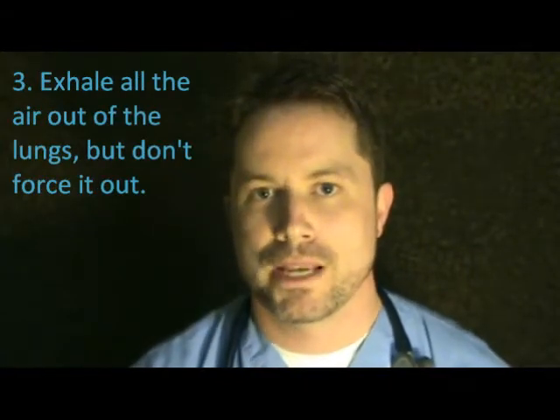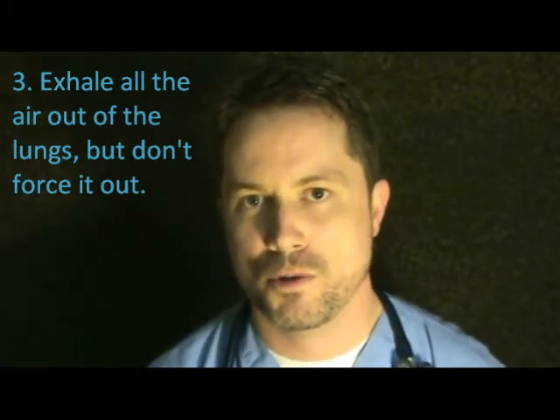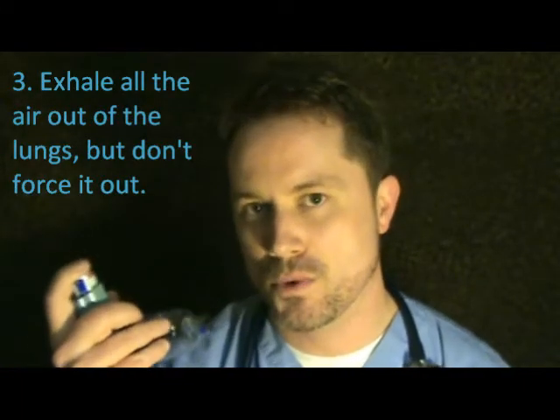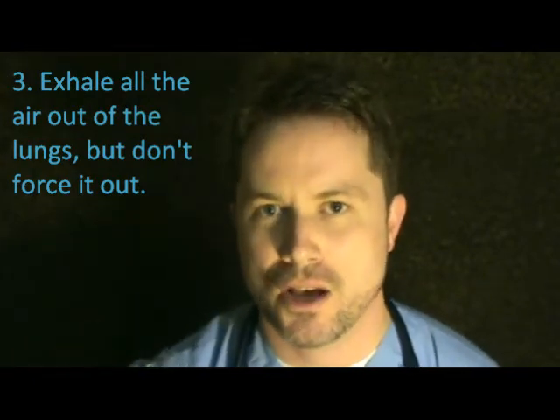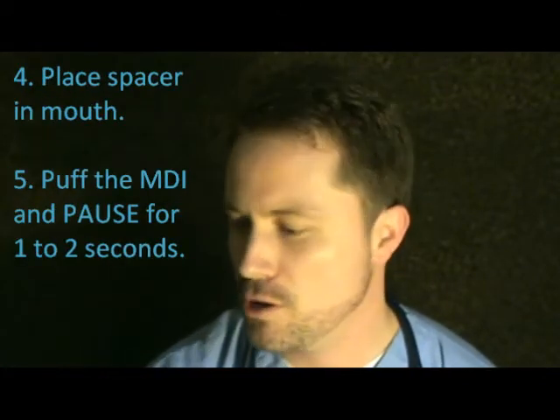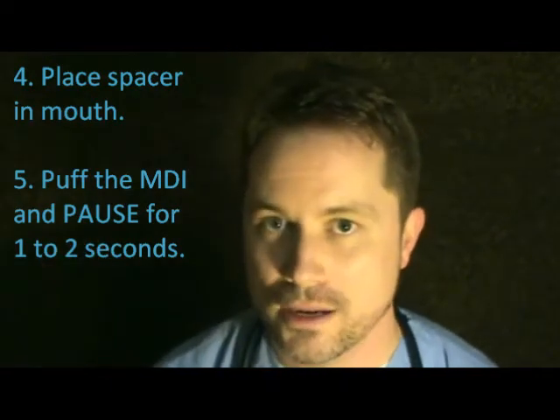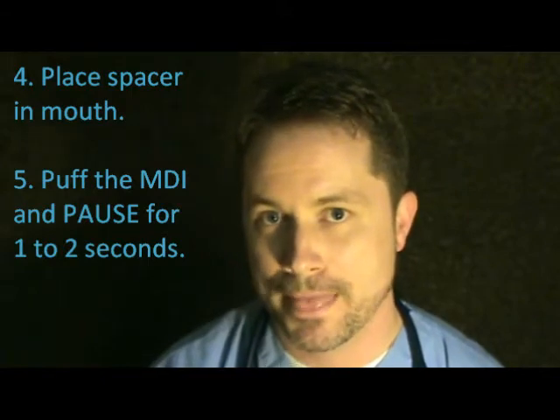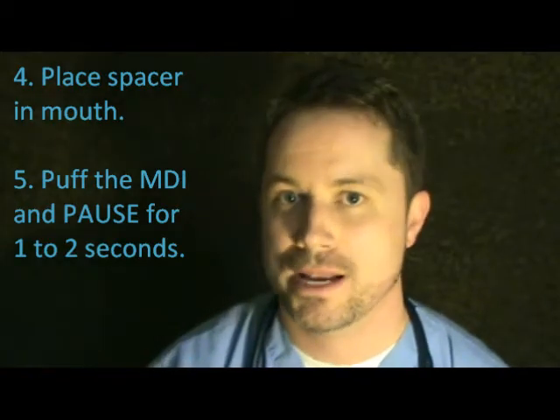So as you're doing your pursed lip breathing and shaking it up, getting ready to do it, blow out. Blow out all the way. The more you blow out, the deeper the breath you can take when you actually take your inhaler. So blow out. Don't ever squeeze or push it out. Just exhale to where you don't think you can have any more air in your lungs comfortably. Put it in your mouth and squeeze and puff. Squirt. Then wait a second or two between that puff and the inhalation. That'll allow you to get a little more medication down into your lungs.